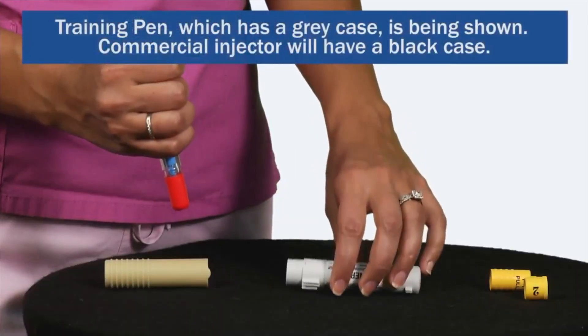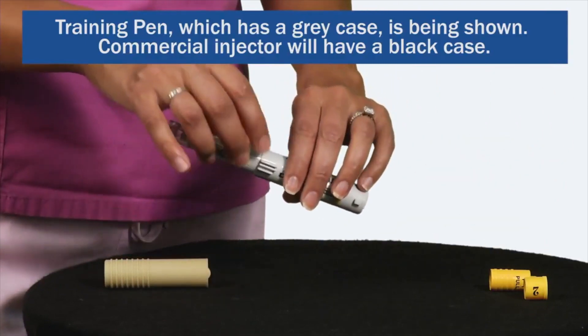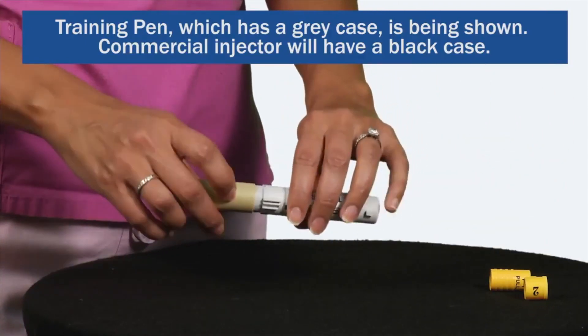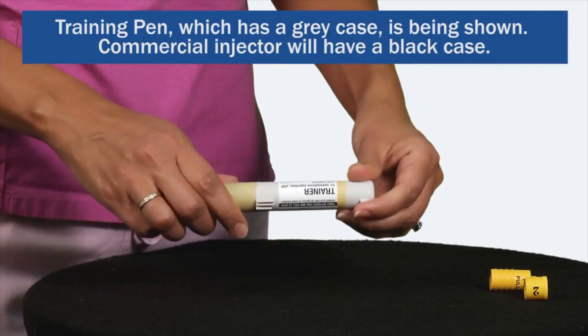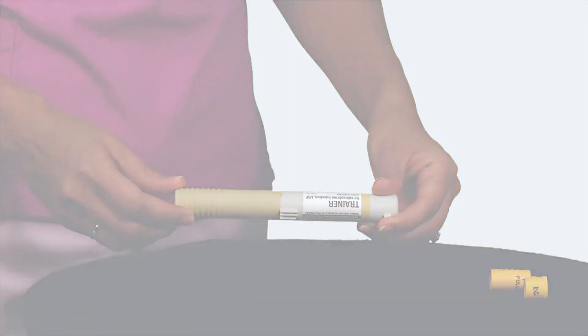After use, lay the black half of the carrying case on a flat surface and carefully slide the auto-injector into the carrying case needle first. Then push the colored half of the carrying case firmly over the non-needle end. Give the auto-injector to emergency responders for proper disposal.